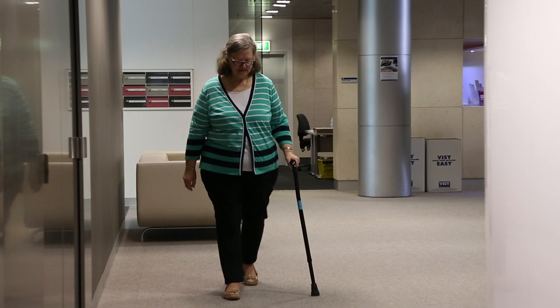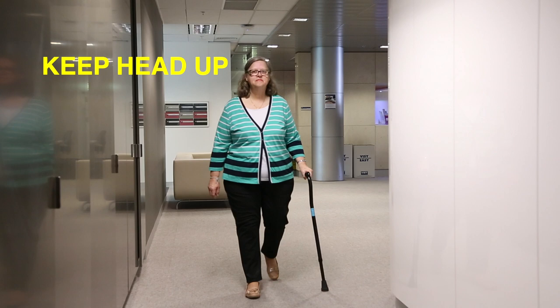You will find the more you walk, the easier the rhythm of the stick and leg combination will become. Try not to overthink the movement; keep your head up and try not to look at the floor.